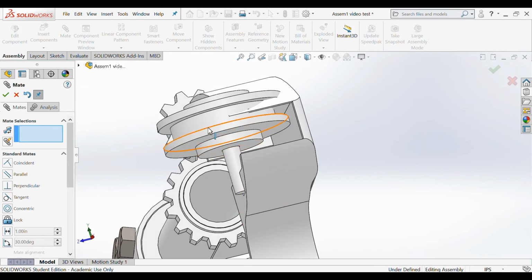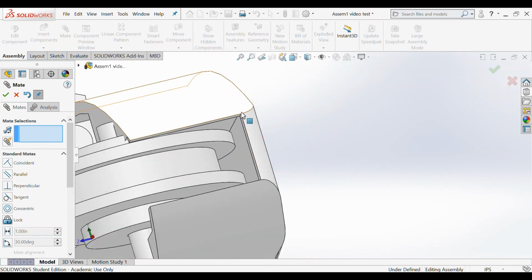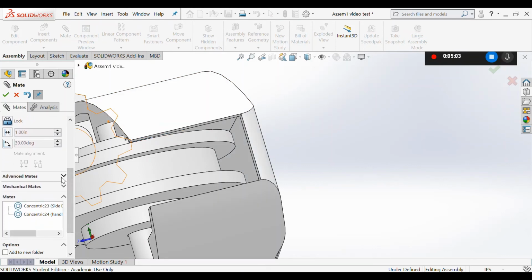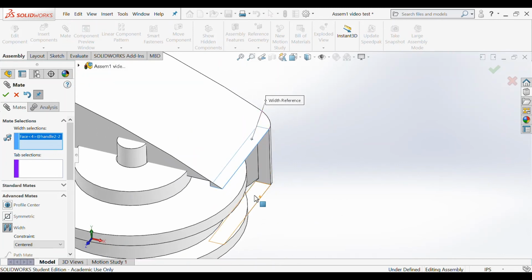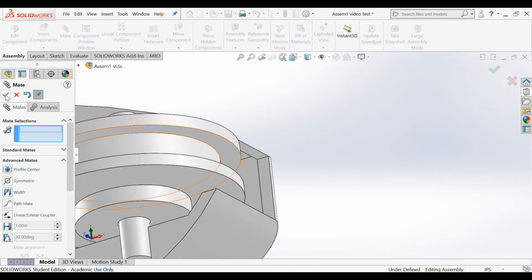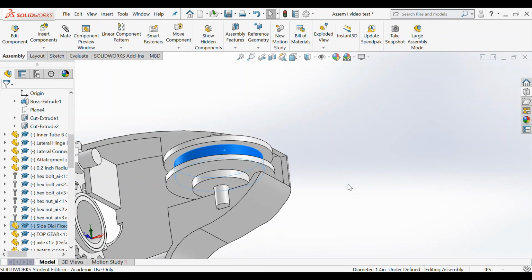Perfect. And then I'm going to use a width mate again, so that this piece right here will be halfway in between this top surface and this bottom surface to prevent any interference. First I'm going to go down to Advanced Mates and Width Mate. And then for our width selections, I'm going to click on this top surface and this bottom surface here. And then for our tab selections, I'm going to choose this face of the side dial and its neighboring face here. Click that green check mark. As you can see, this guy can rotate, but won't be moving around in the X and Y direction.